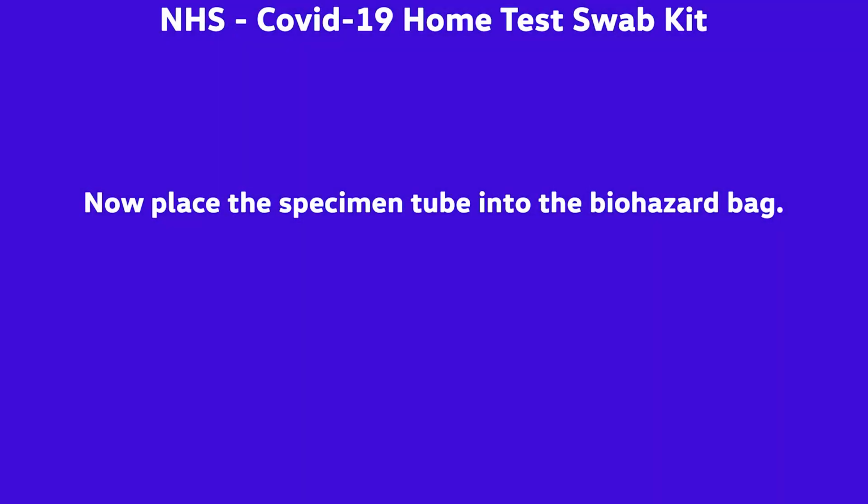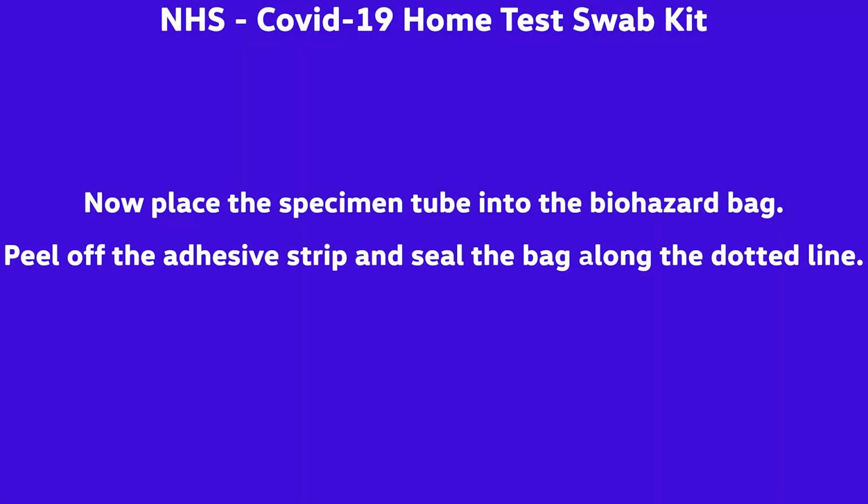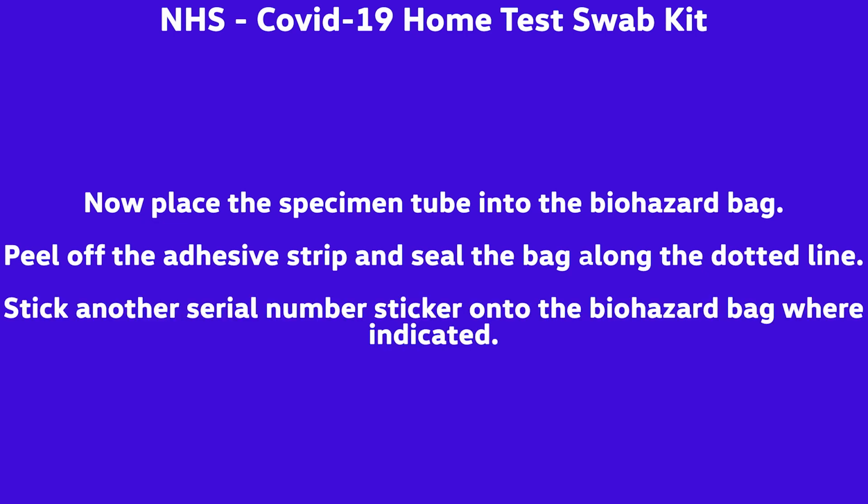Now place the specimen tube into the biohazard bag. Peel off the adhesive strip and seal along the dotted line. Place another serial number sticker onto the biohazard bag where indicated.